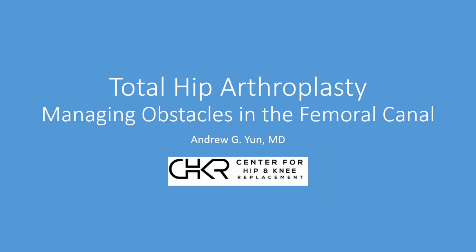So this is a complex topic, but as a quick review, there are two types of obstacles in the femoral canal. There are external mechanical obstacles, and then there are internal biologic. For external, you need three things. One, the manufacturer, so that you can have appropriate instrumentation. Number two, the approach, so you know how you will retrieve the hardware prior to the hip replacement. And then three, the templating, so you know where and how to position your femoral stem. The internal and the biologic are a little bit more complex. You'll often need adjunctive imaging, and you'll need special tools that allow you to gain deep access into the canal to bypass the obstacle.